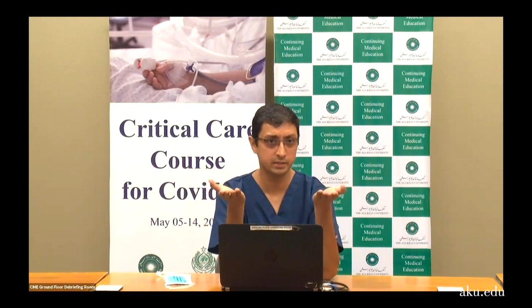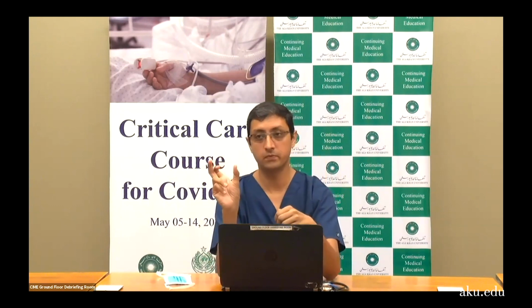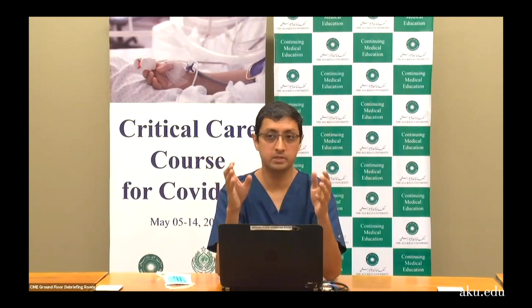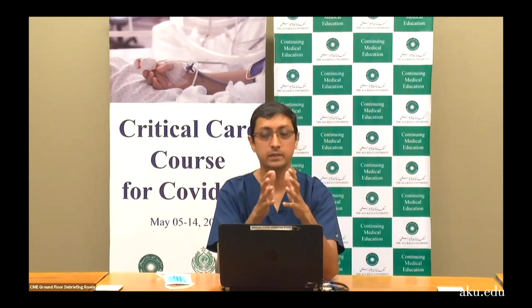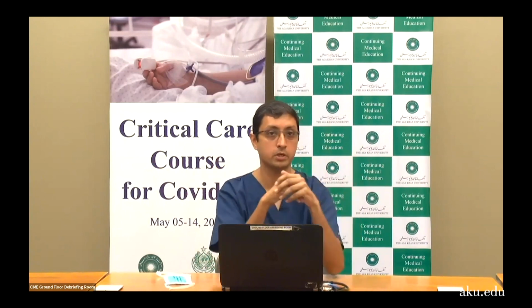Generally speaking, both are the same, because with the control mode, at a specific pressure of 12-15, a tidal volume is delivered. So you start with that and you work your way down. And if the patient is triggering frequently, then we move from pressure control to a SIMV mode or a spontaneous mode.